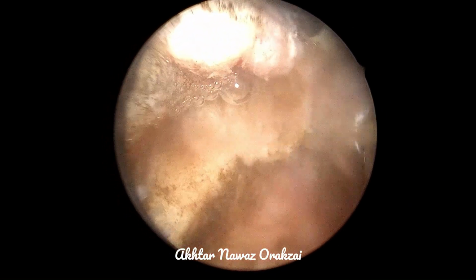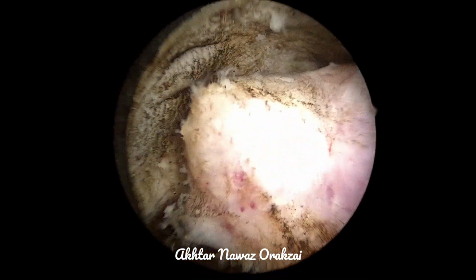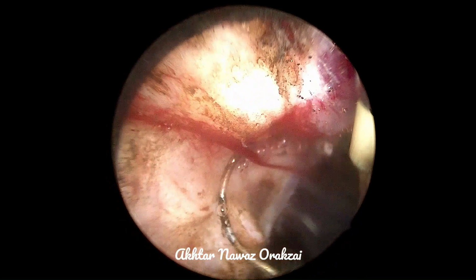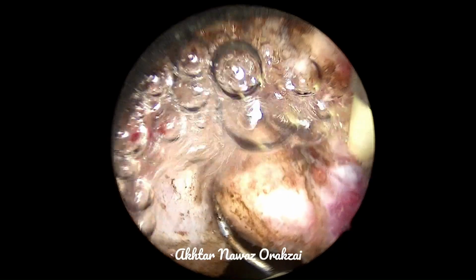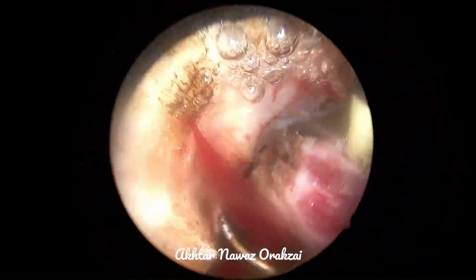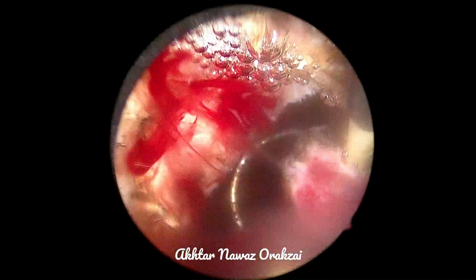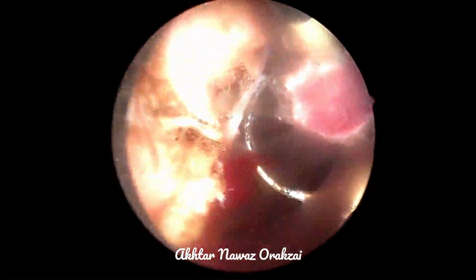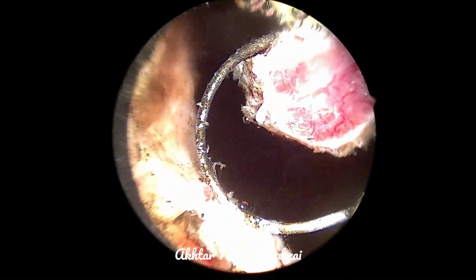As I already said, in this patient particularly, the erectile function needs to be considered, number one. Number two, retrograde ejaculation needs to be considered, and the most important thing is that the patient should have symptomatic relief. So the important thing about transurethral resection of the prostate that one should be clear of is that this is a procedure for symptomatic relief. It is not a radical procedure. So we do not necessarily need to remove the whole prostate.